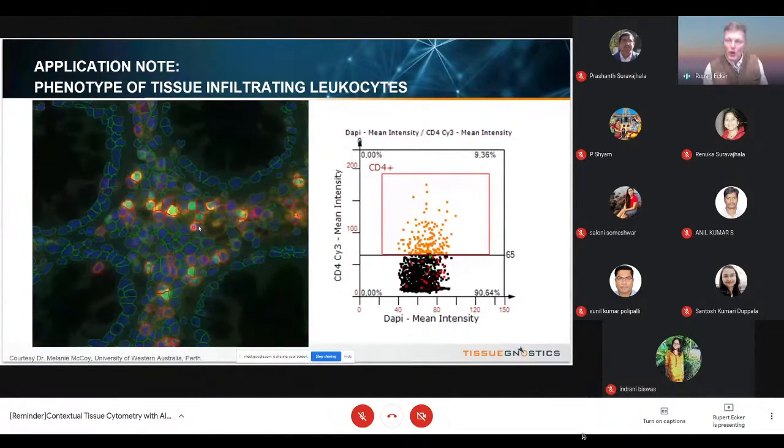Others have only a little bit of CD4, so a little bit of yellow. They will be somewhere close to the cutoff, but still above the cutoff, meaning still referred to as positive. And all the cells with green contours are below the cutoff, so they do not have a specific staining of CD4, of yellow, and are therefore referred to as CD4 negative.